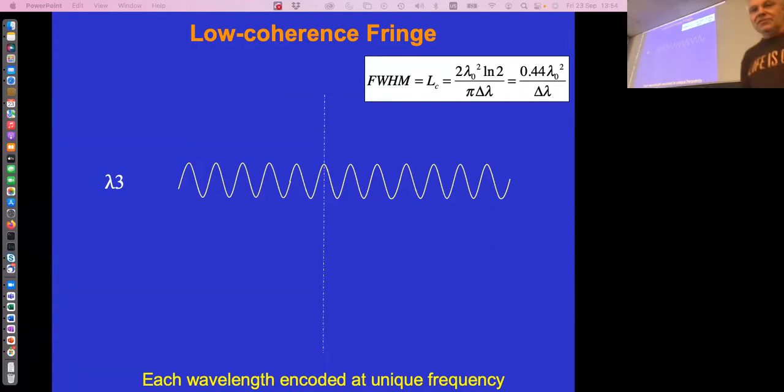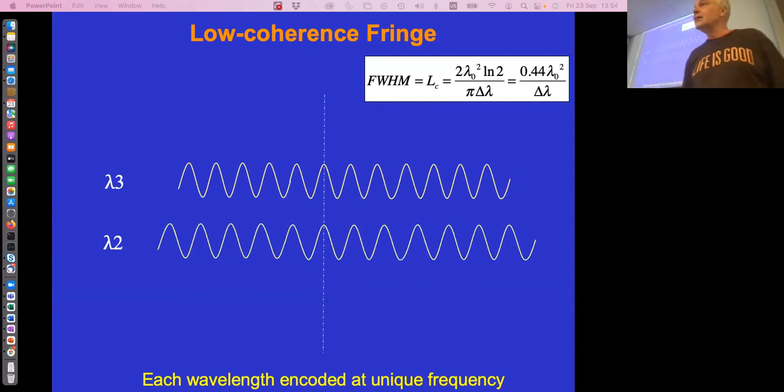Okay, let's turn off this laser and turn a second laser on with a different wavelength. Here we see again, for wavelength 2, the interference pattern when we move the reference arm mirror. Which of these two wavelengths is longer? Can you deduce that from this graph?